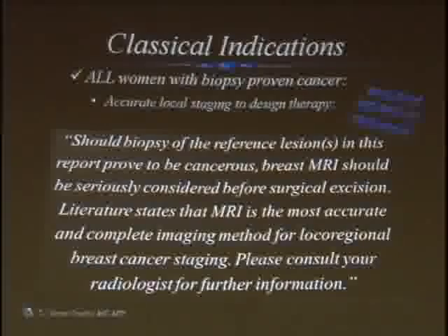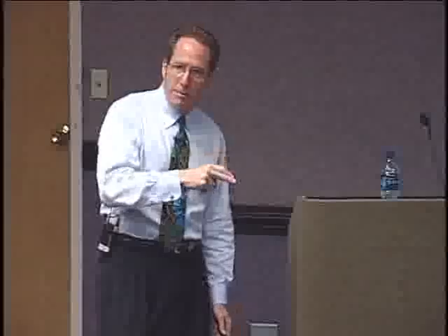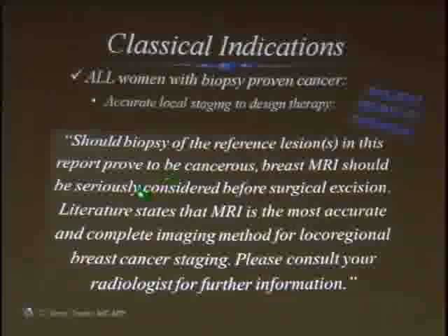And I'll tell you, most surgeons, even in our region, don't know this, even though it was in one of the biggest medical journals there is. They don't do this on every one of them. So we push them a little. On all of our mammograms that are 4 or above, we add a canned statement that is a reiteration of that paper and the national guidelines. Should the biopsy of the reference lesion in this report prove to be cancerous, breast MRI should seriously be considered before surgical excision.